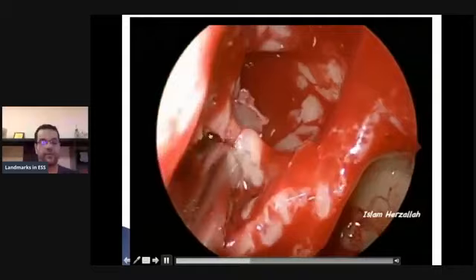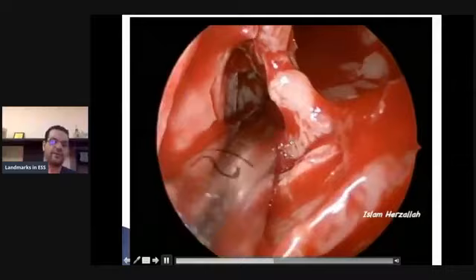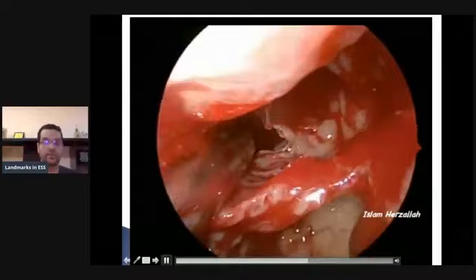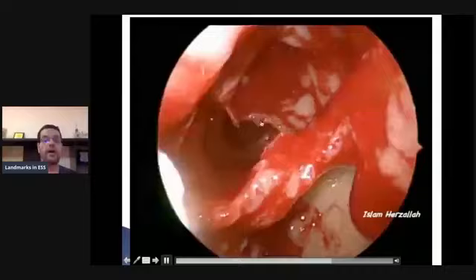And then just by doing a little bit of trimming of this area, I entered into the sphenoid sinus opening. Remember, now I'm shaving, but I'm not shaving inside the sphenoid sinus. I'm just shaving at the opening. And while you are shaving at the opening, remember, you can actually endanger the septal branch of the sphenopalatine artery, but it's not a big deal, but you need to be prepared just in case you injure this. I actually prefer not to injure it at all by dissecting the mucosa a little bit, but it just came across in this case.